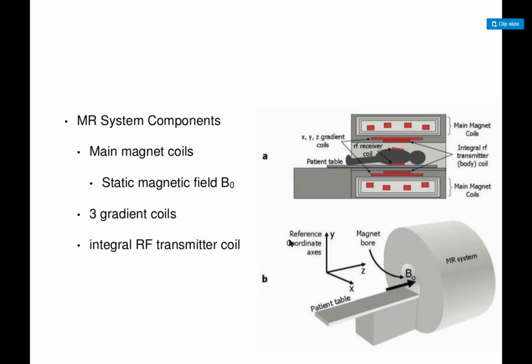So in MRI, they found this phenomenon that the body or anything can be magnetized.